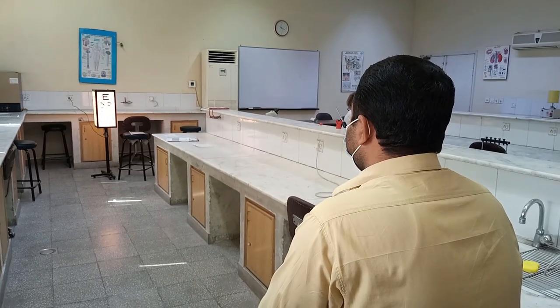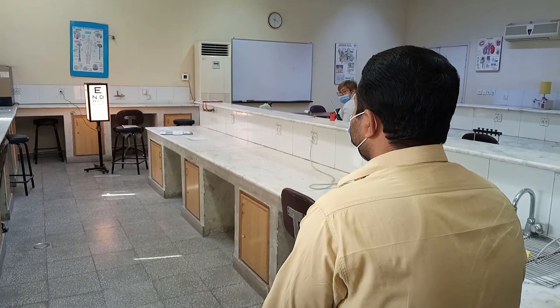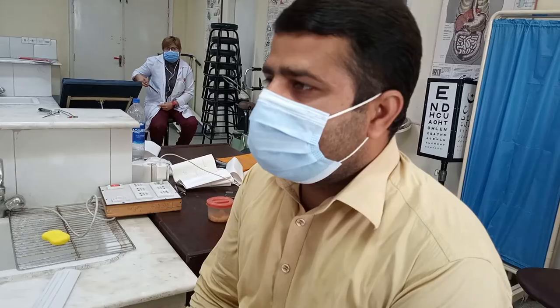You will ask the person to sit at a distance of 6 meters from the chart and you will turn on the light of Snellen's chart. So now Amir Saab is sitting at a distance of 6 meters from the chart, and you can see that the Snellen's chart light is on. You will start with testing the right eye and you will occlude the left eye of the person.